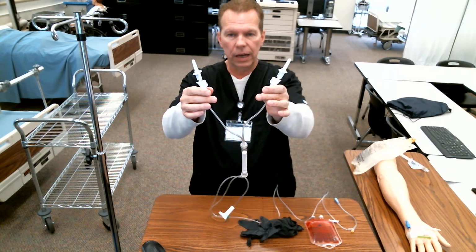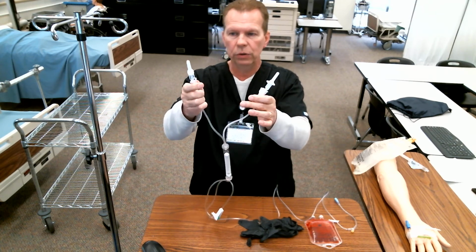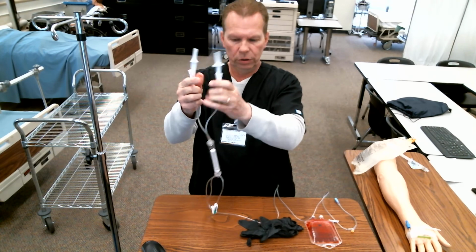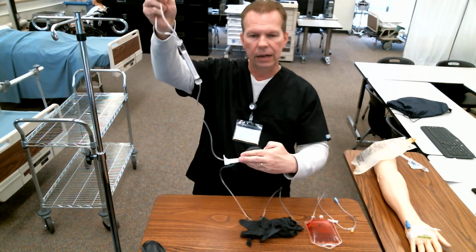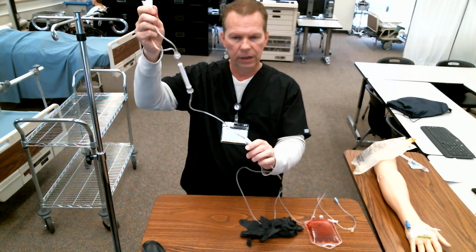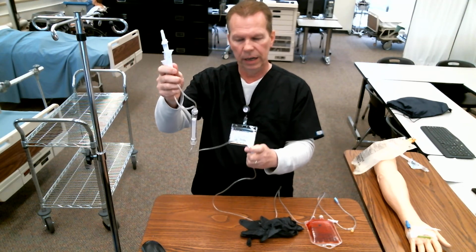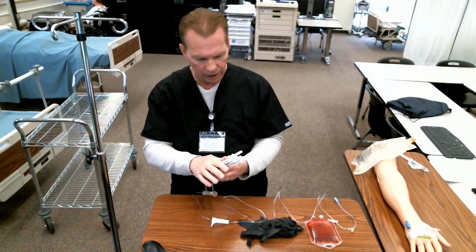So this has 2 clamps right here. So you've got to shut off 2 roller clamps. So 1, 2. Then you have a main regulator clamp down here. So that's a 3rd clamp that you have to close off. Okay, so make sure you close all 3 of those off.